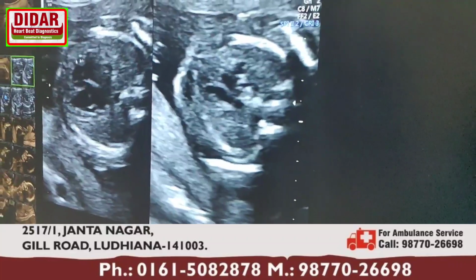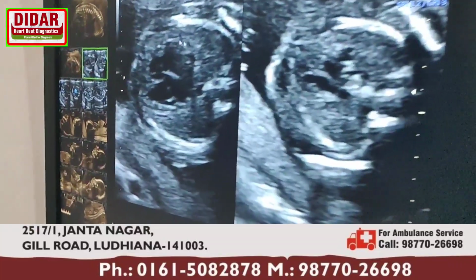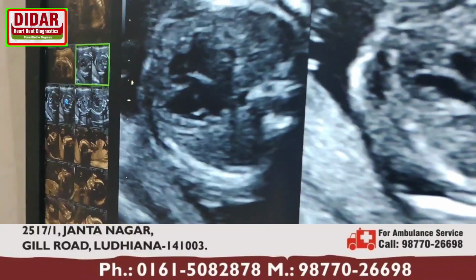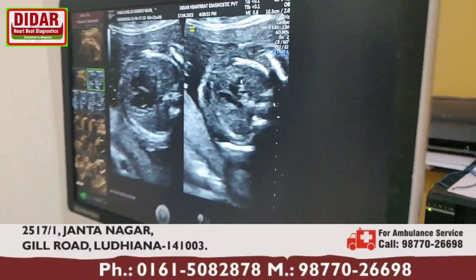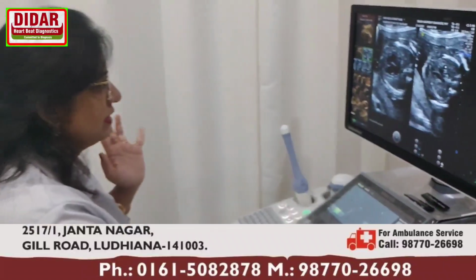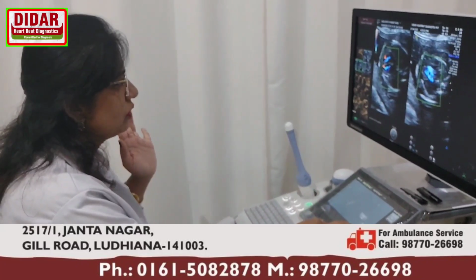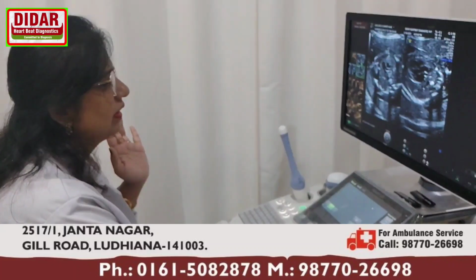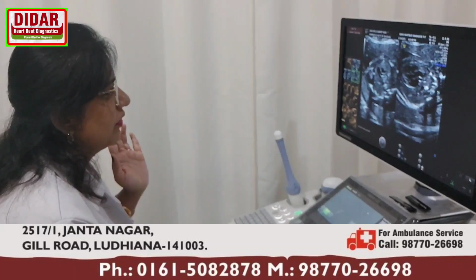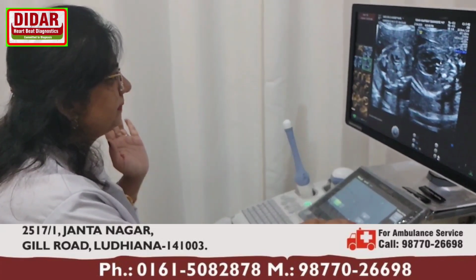In our heart there are four chambers. So we see the four chamber heart, and then the three vessel view. There is RVOT, LVOT and superior vena cava. Then on color Doppler also we see both the views again. Then again RVOT dividing into two and LVOT in the center.